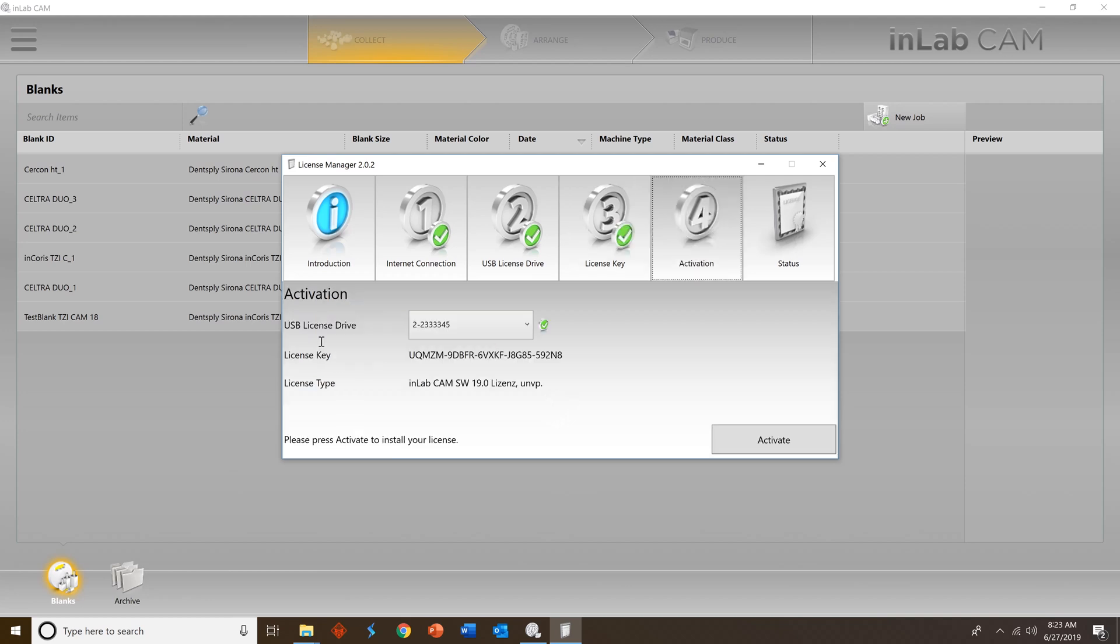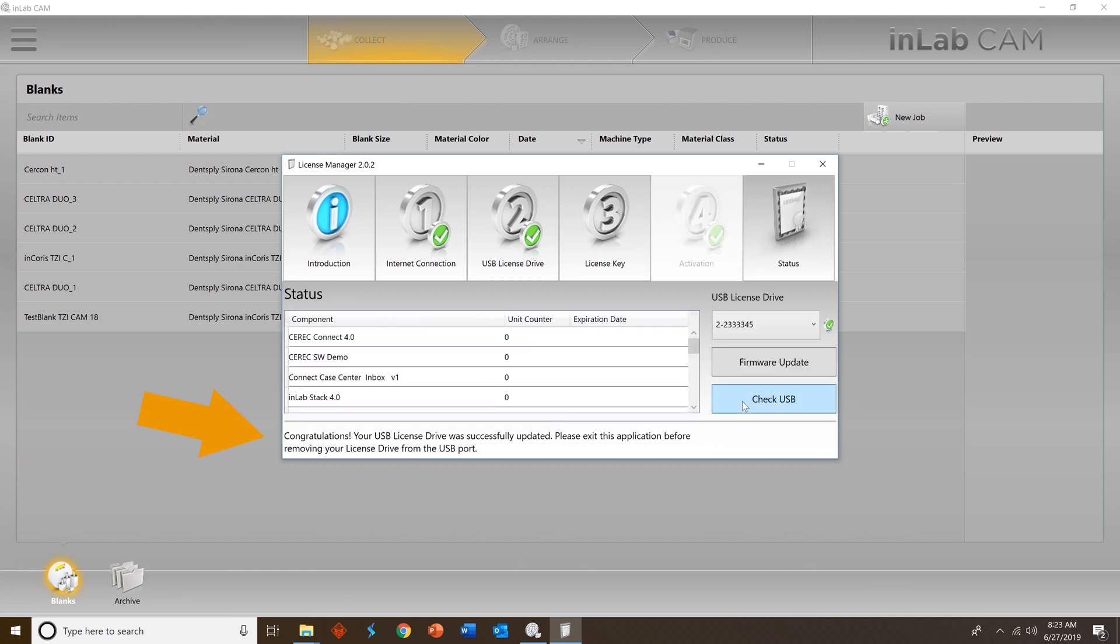You will then see the InLab CAM 19 is indeed that license key. Press activate and then when it's active, you'll receive a congratulations message.